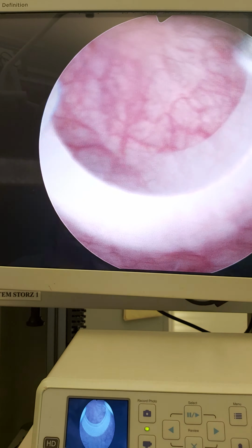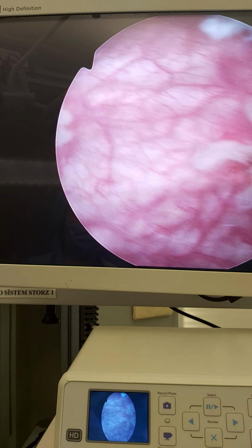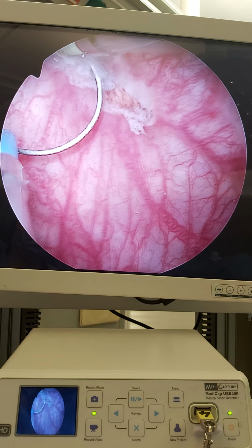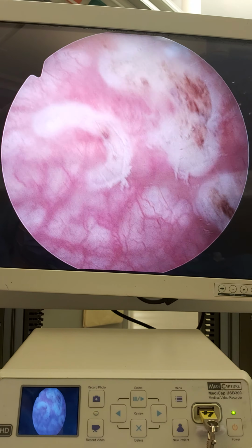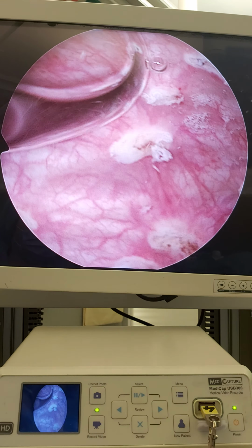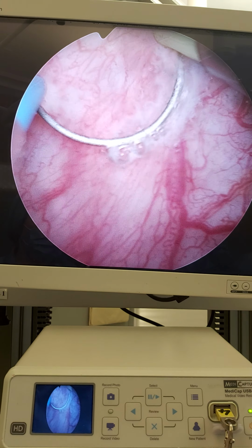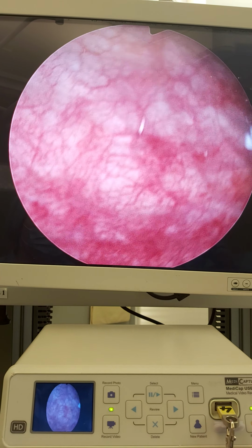Okay, now I am fulgurating this before the Trigon. I will now make some fulguration spots in the bladder in patients who have a diseased bladder. I hope this will let new mucosal growth here, and may also work in interstitial cystitis patients. Just when you fulgurate a spot, there will be a tissue healing reaction here, because we can't fulgurate all the bladder walls.